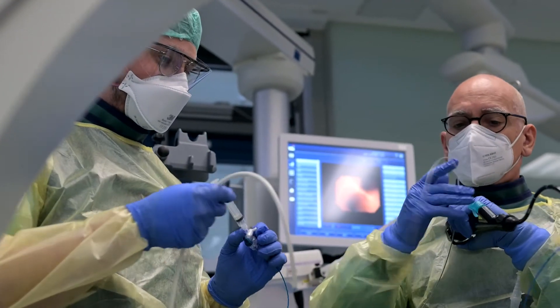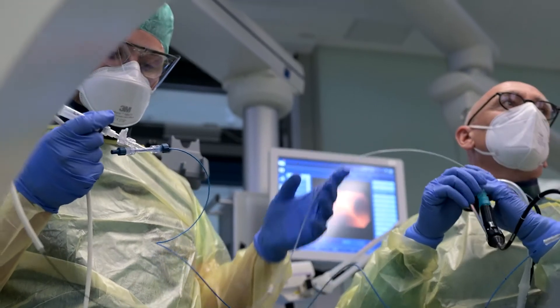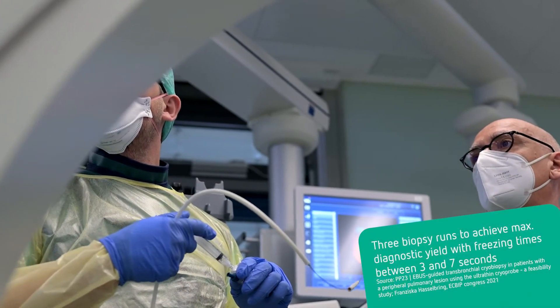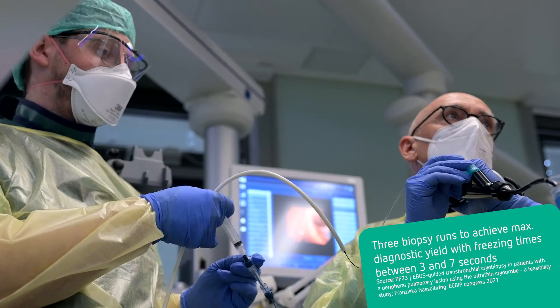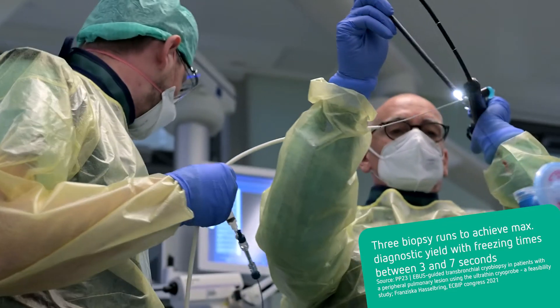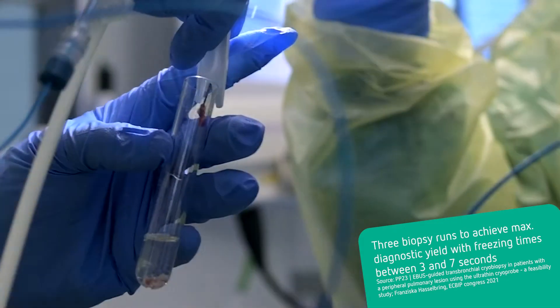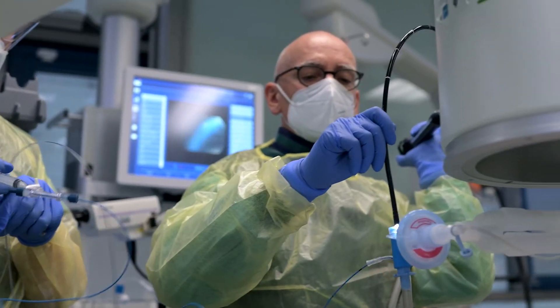Depending on the clinical setting, technique, and disease state, lower freezing times for cryobiopsy have also been found to enable harvesting of samples adequate for diagnosis, while lowering the fundamental risk for bleeding. With the help of the removal tool, the sample is gently removed from the tip of the cryoprobe. Forced removal attempts using forceps or sharp instruments should be avoided to preserve high quality for following examinations such as histology and molecular target testing. The conditions under which the sample is stored and transported should be defined as per institutional pathologist guidelines, taking into account the desired examinations.